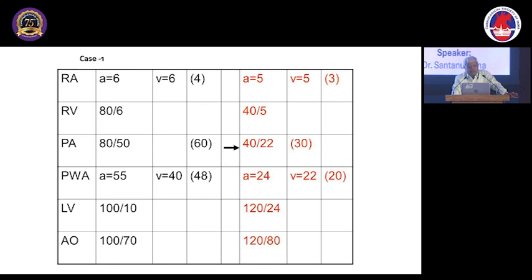This is only the pressure study, no oximetry. Sir, PCWP is more, and there is a gradient between the LA pressure and LV pressure. So what is the diagnosis? Mitral stenosis. Very good. There is a tight mitral stenosis with pulmonary hypertension. Excellent. Now you have done a BMV.